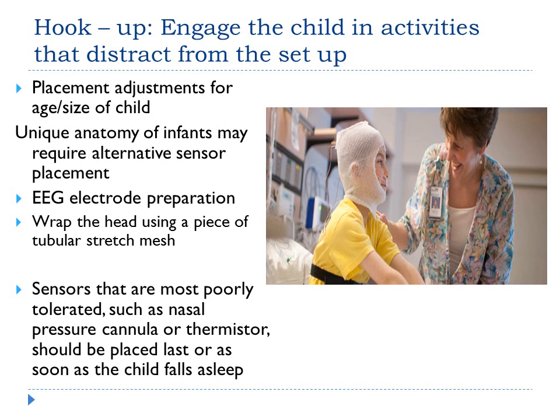Okay, so let's take a look at some unique factors in regards to the hookup with a pediatric patient. We do still use the International 10-20 system for electrode placement in order to determine correct electrode placement. However, when you are marking your spots on their head, you want to make sure you're using non-toxic, water-soluble color markers, and you might want to allow the child to choose the color just to make it fun for them. It gives them a sense of control of the situation, and it might help put them at ease.